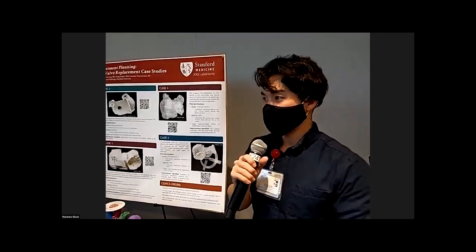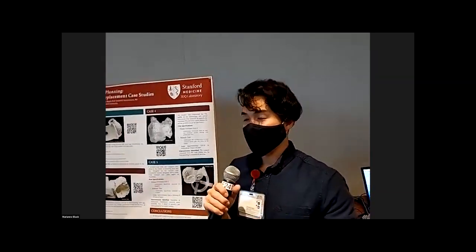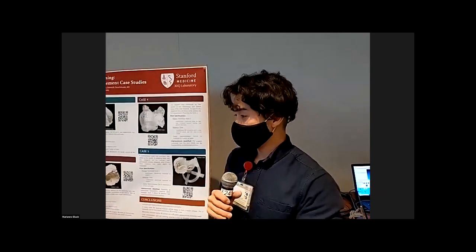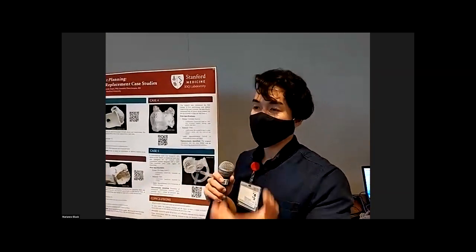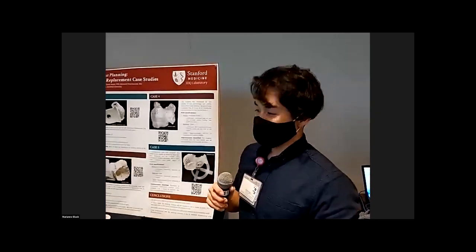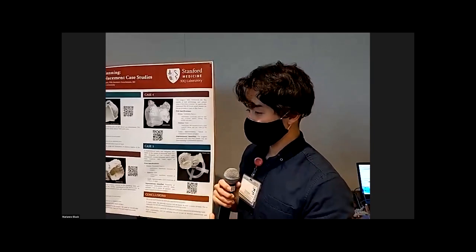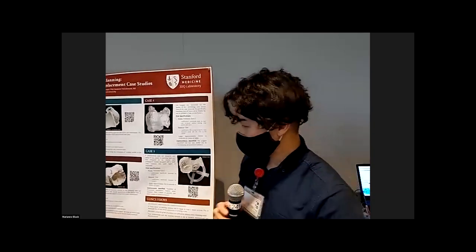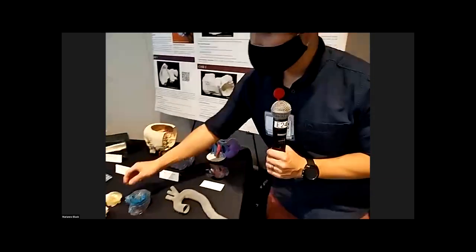We mostly do 3D imaging and quantitative analysis of CT and MR studies for the adult and children's hospitals. On top of that, we also do 3D printing for surgical planning and patient education. Basically anything that the clinicians want us to do, we'll try our best to achieve it. We have a variety of different types of hard and soft materials. We can mix them in any combination to get models that are clear, with color, models that are flexible.